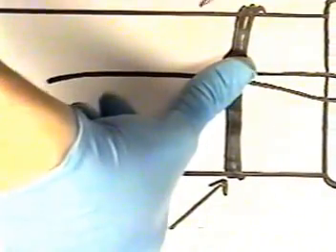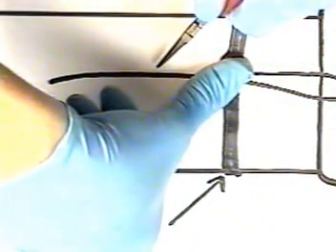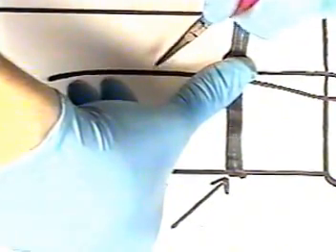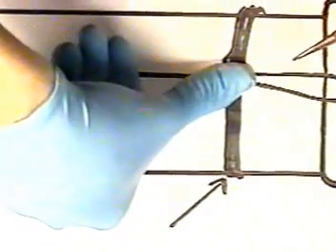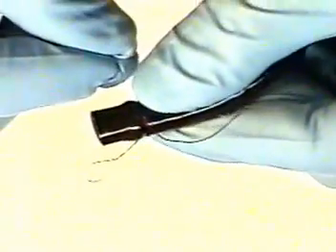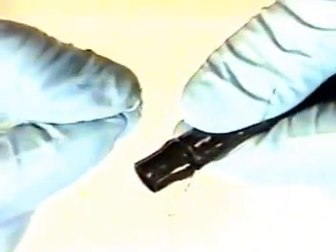If you pull the wrong loop, you will pull on the initial thread. This is to be left in place and not pulled through. You will find the thread that pulls underneath the initial 3 to 4 bindings. Once you have pulled the binding through the 3 to 4 turns, we can now continue without holding your fingers over the loop to bind all the way up, right up against the distal end C cover.